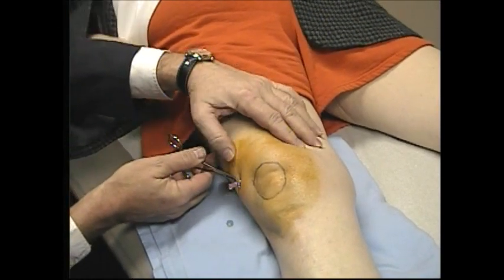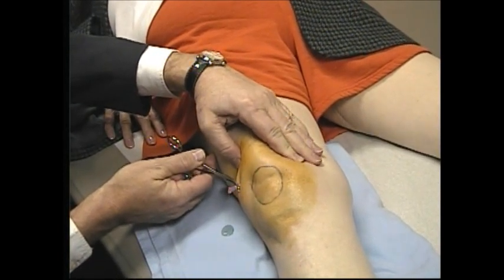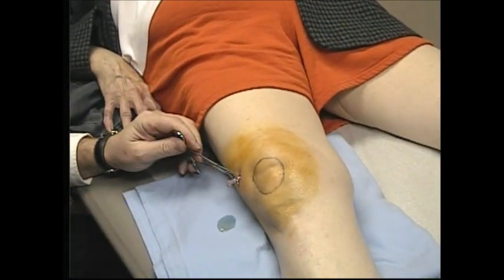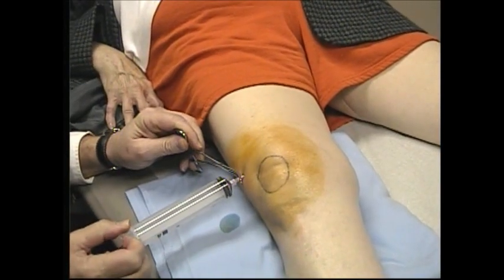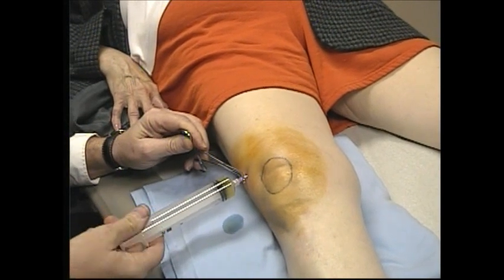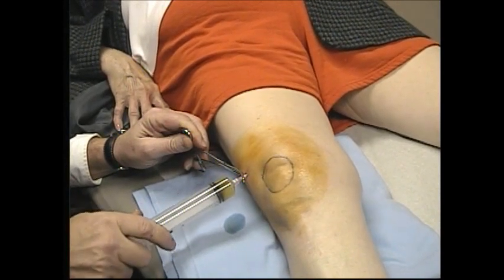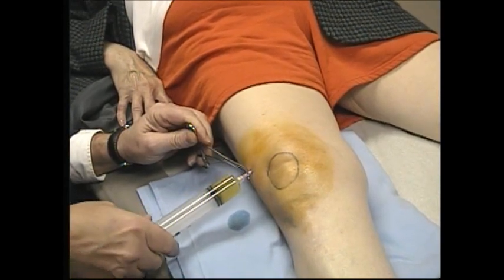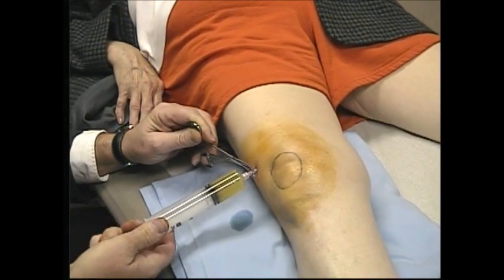If we press on here, you can see that we can get some more fluid out — just manipulating the knee a little bit and letting it come out. That's fairly easily flowing. And you can see it's kind of viscid, which again gives you the impression it's not infected. We'll go ahead and draw out some more. You stop when you start feeling some pretty good back pressure on the syringe — that's the time to stop and see if more wants to come out if you feel there's still a lot in there.